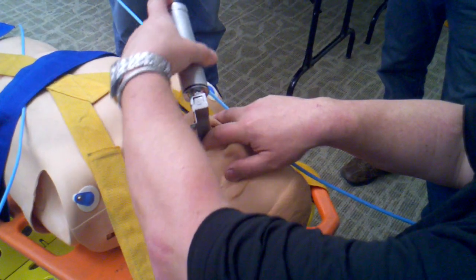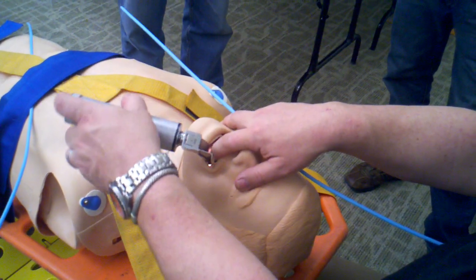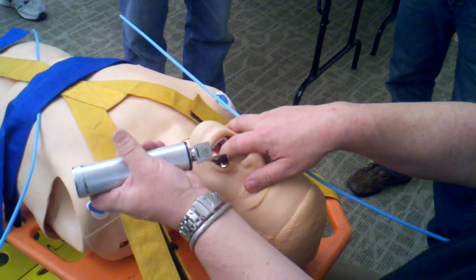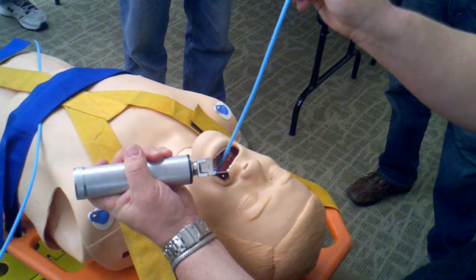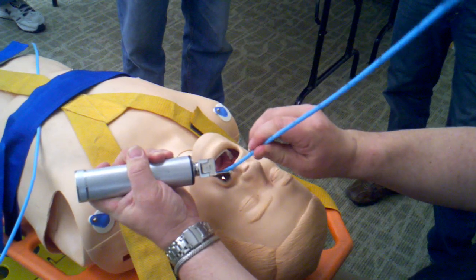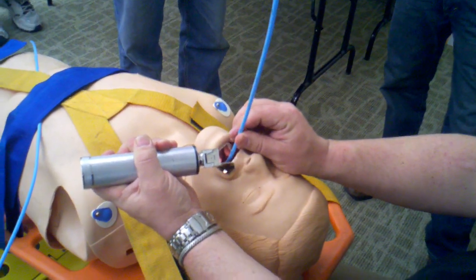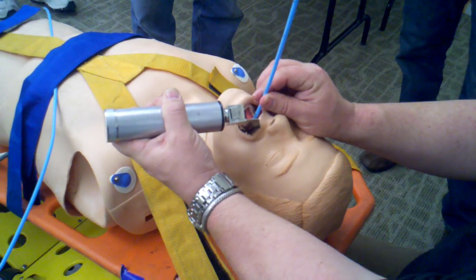Using a finger and thumb, we're going to rotate the blade, rotating the handle around to a 45 degree angle over the left shoulder, and then lift the tip of the blade. We've bifurcated the tongue, and we're now going to slip the bougie down through the bifurcation along the blade into the trachea. Once the bougie is well anchored, we load the tube, leaving the laryngoscope in place, and advance the tube into the trachea.